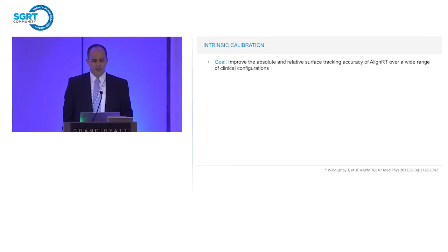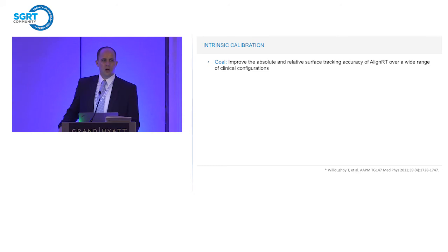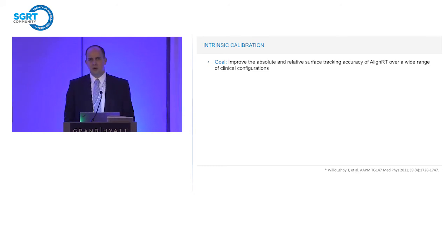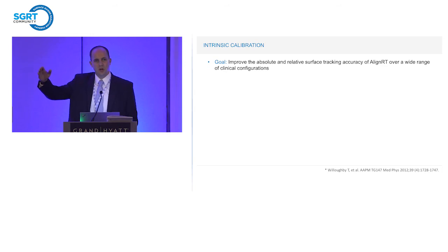So our goal is to take a look and see, is there any way we can improve the tracking accuracy with AlignRT, looking at a wide range of clinical configurations. Within SGRT in general, there are some more challenging configurations. For example, when we're treating with couch rotations, when the gantry is blocking one of the pods, when we have a very deep isocenter, that's a challenging configuration for SGRT.